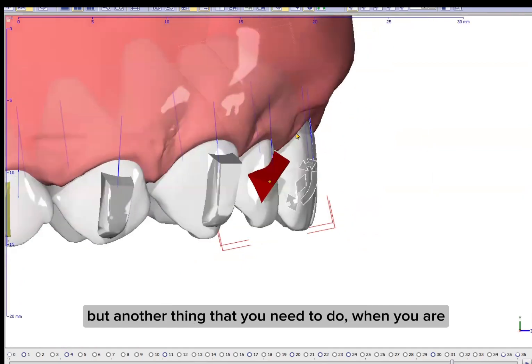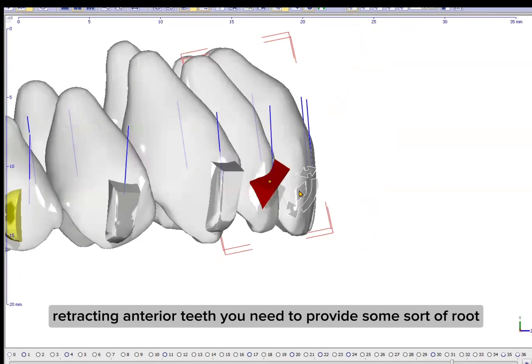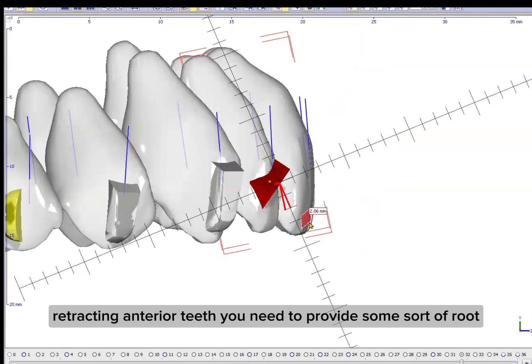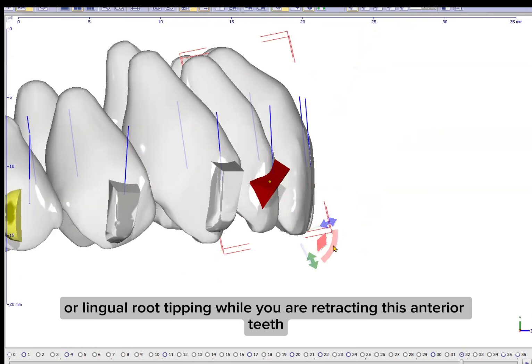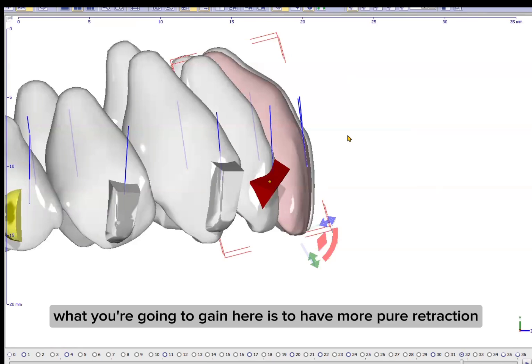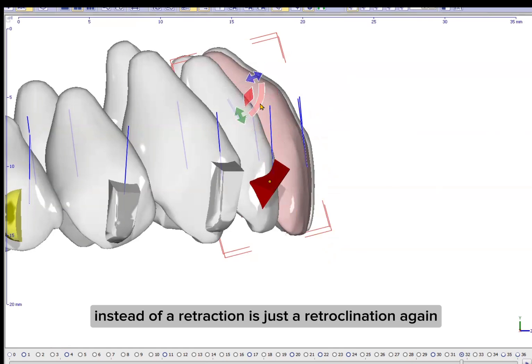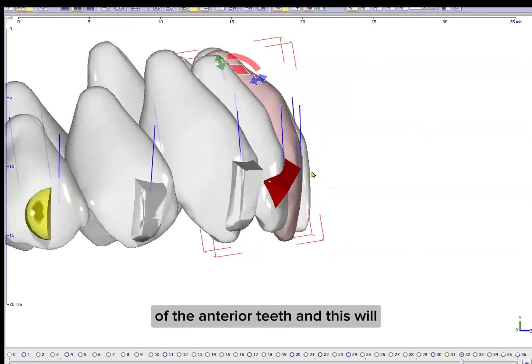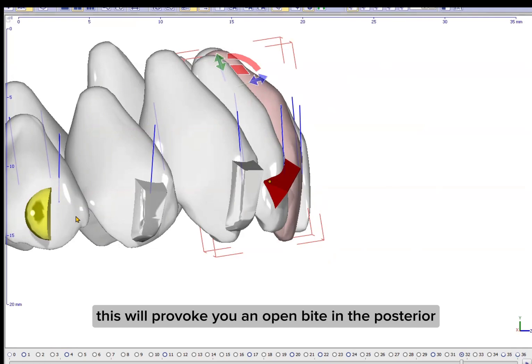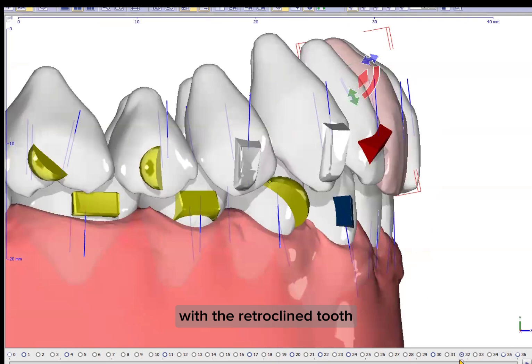Another thing that you need to do when you are retracting anterior teeth is to provide some sort of root palatal or lingual root tipping while you are retracting these anterior teeth. Because what you're going to gain here is more pure retraction instead of just a retroclination, because the force is acting on the crown. And if you don't plan any root movement, what you're going to achieve instead of a retraction is just a retroclination of the anterior teeth, which will provoke a posterior open bite.